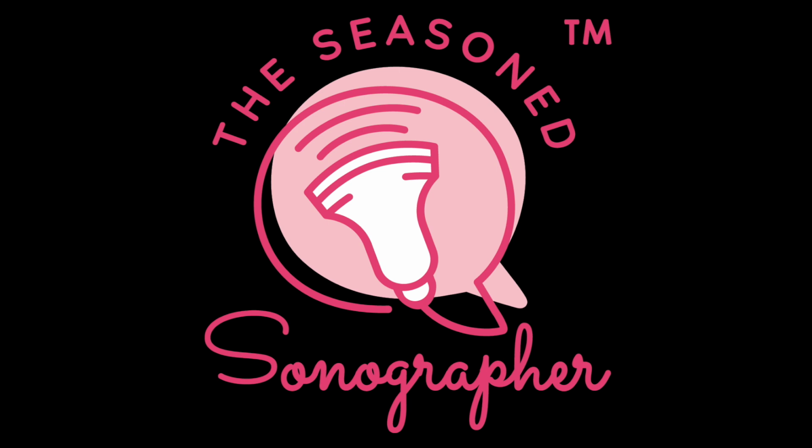You can assess for multiple gestation, twins, triplets, and evaluation of a suspected pregnancy failure. Perhaps the gestational sac might be low in the lower uterine segment, a miscarriage in process, or it might be irregular. You want to follow up after any IVF or assisted reproduction after they're released.